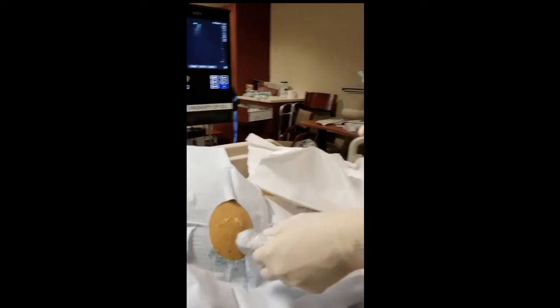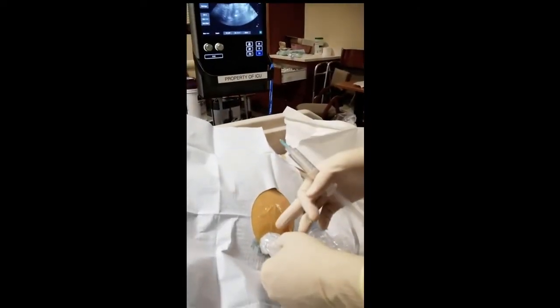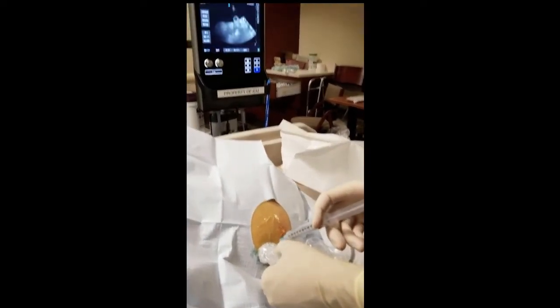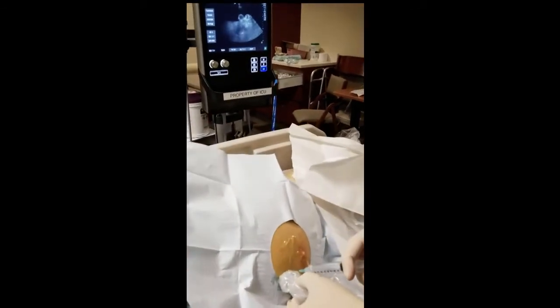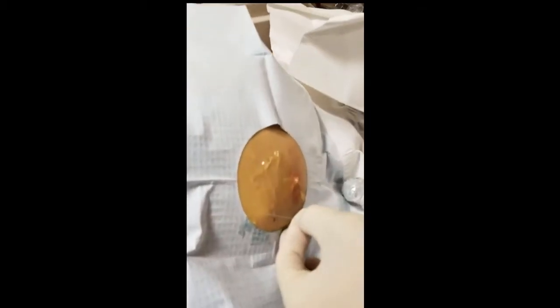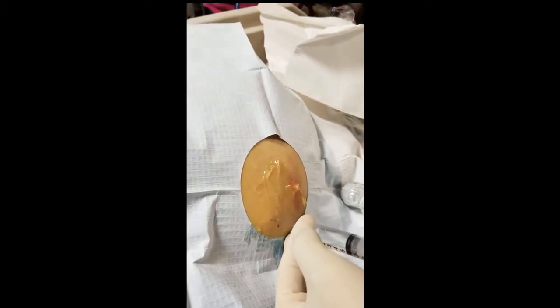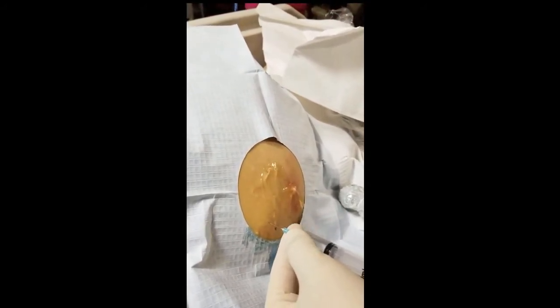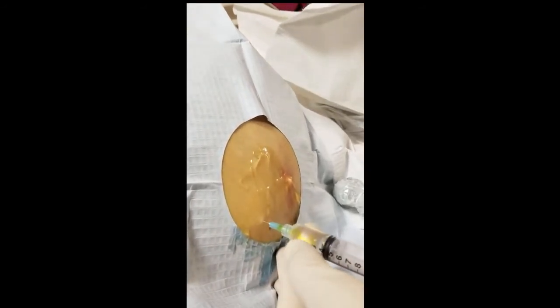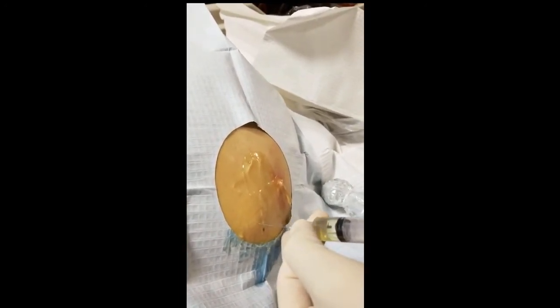There are two different ways to do this — you can do it live, or after you find where you want to go, you could mark the skin. I'm going to do it live. So I have my live spot right there. I'm going to go in and, with a small pinch, get my wheal. I can see a bit of a wheal there. Then I'm going to track down a little more in the area I'm going to be working, and numb up a little farther. You could also use this to pull back and see when you get in — right there I got in, because I can see some yellowness coming. So I can check the depth.